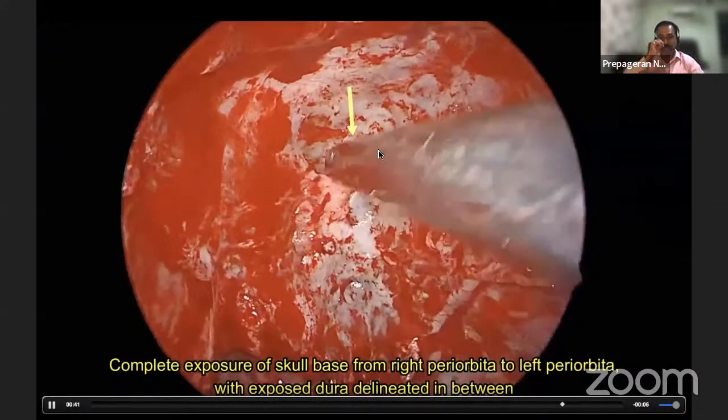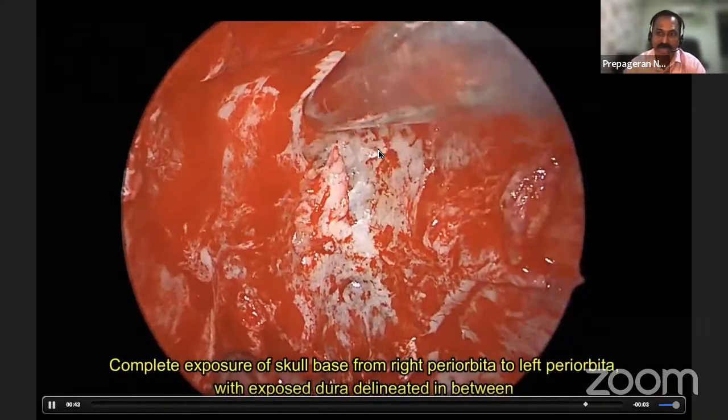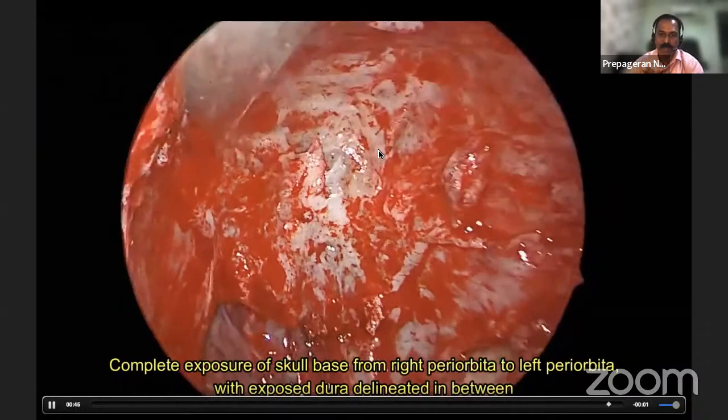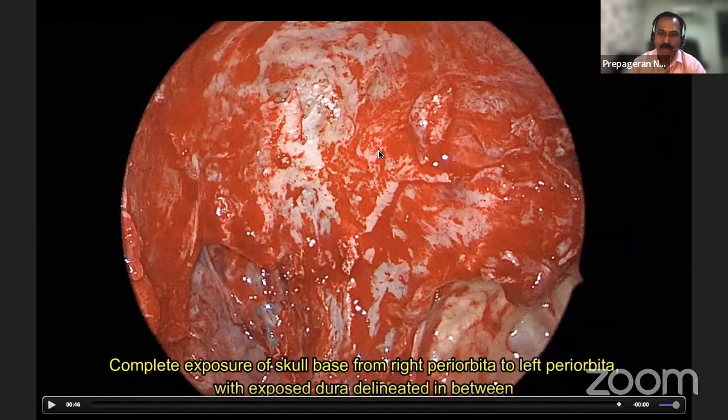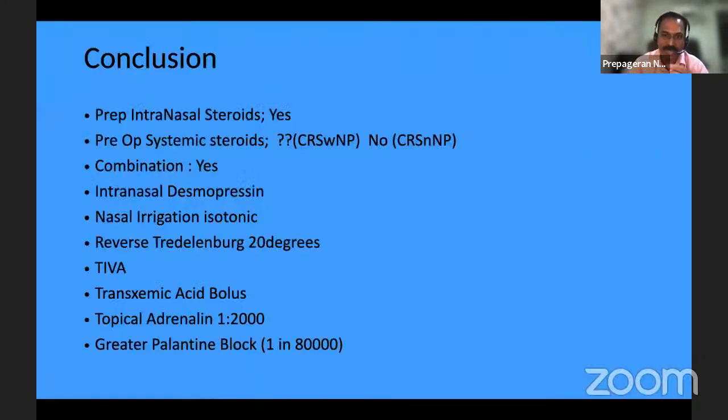So this surgery took us around half an hour, and we lost less than 100 ml of blood simply because of the embolization that we had. So I just wanted to show you that in selected cases, embolization works very well. This was a spindle cell hemangioma.